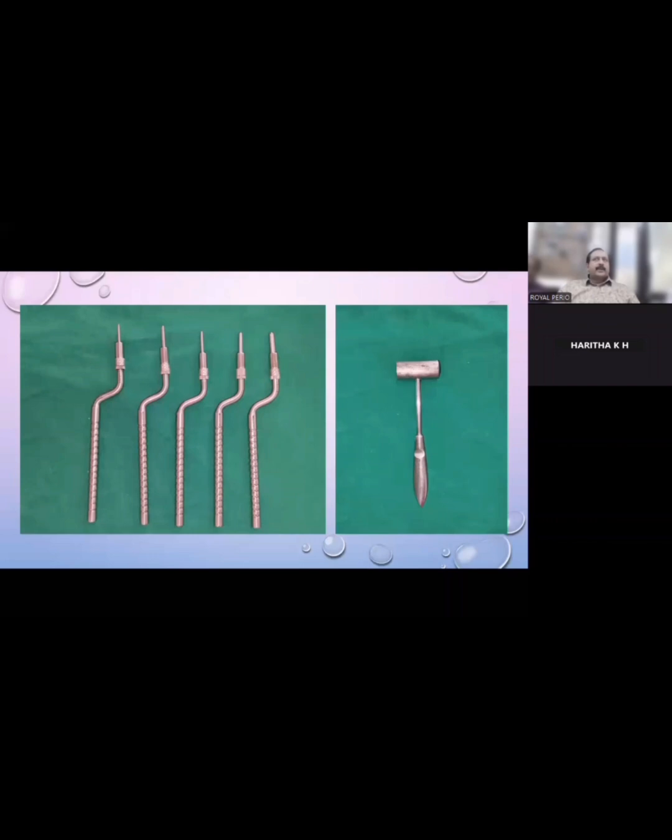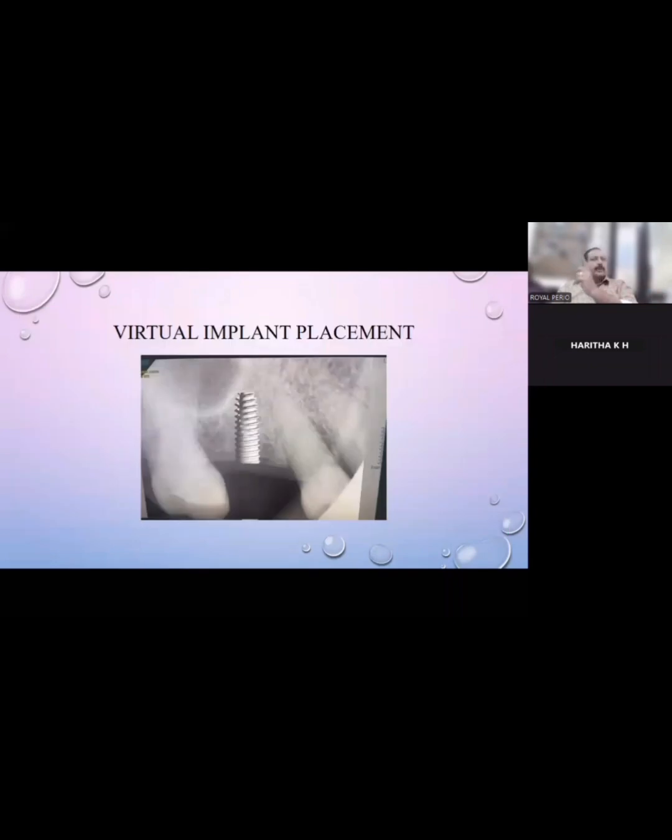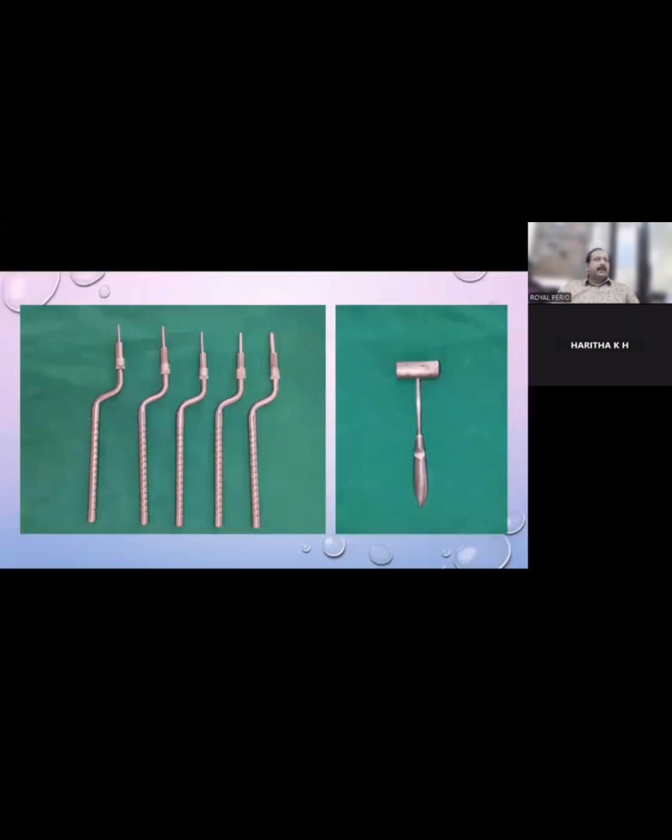Since you're going to place 4 implants in that region, wherein you're planning to replace 6 to lateral, 6 to lateral, so that means 8 teeth, 8 teeth with tongue thrusting. Minimum 4 implants. Minimum 4. So that's quite a good amount of support as well.